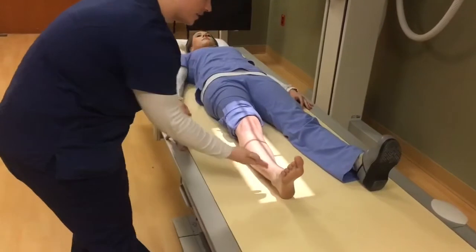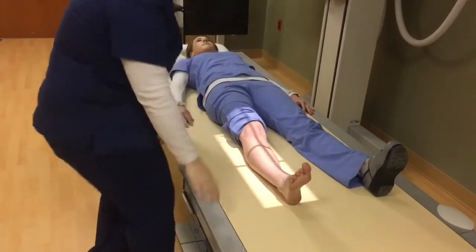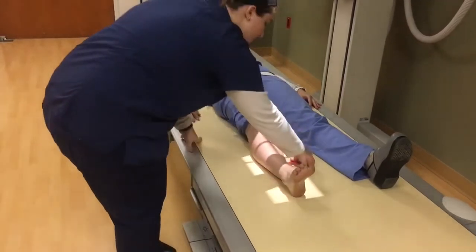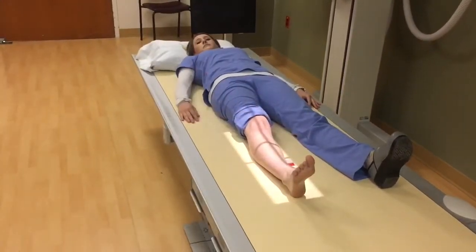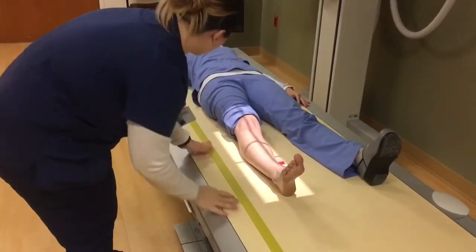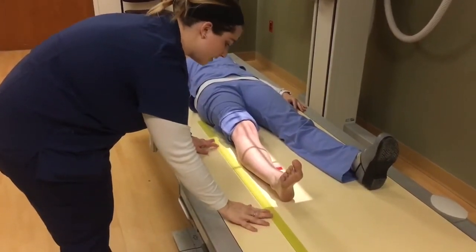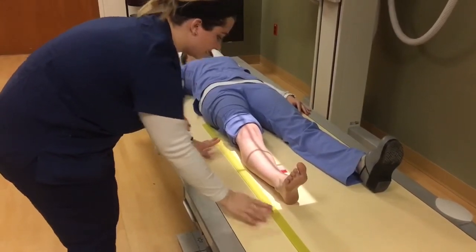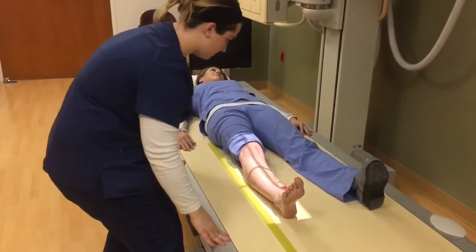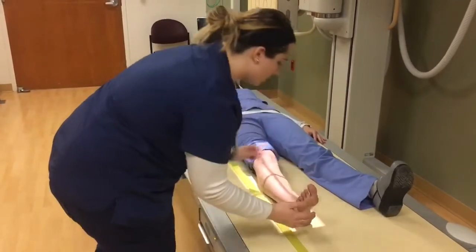For the tib-fib, we want to include the ankle joint and the knee joint and adjust our light field as necessary. I want to put my right marker in, and for stitching, we use a ruler, and this is how the computer is able to line up the images. It doesn't matter if you include one end of the ruler, it'll just read the dots on the ruler to line it up. We should slide it in so that it's not in the anatomy of interest, as close as we can. And now, we are ready for stitching.